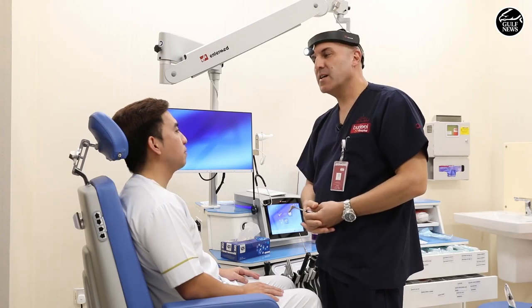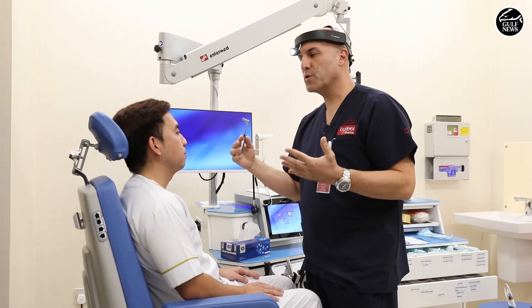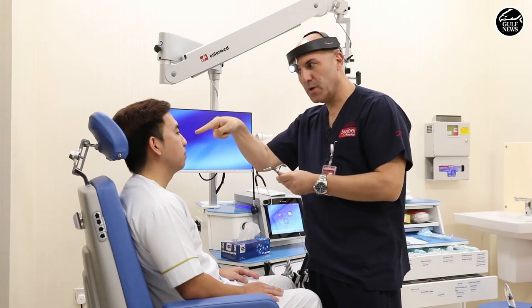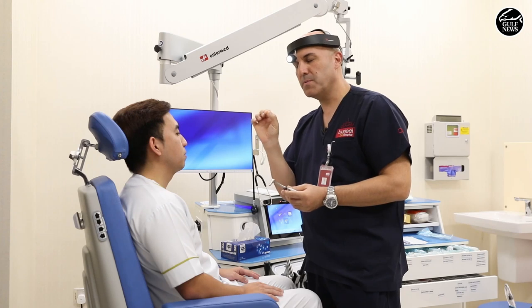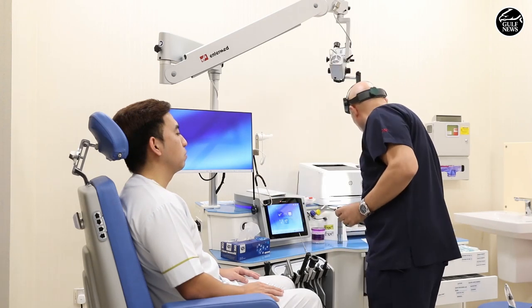So we'll start with the nasopharyngeal swab. It's very important to know that the nose — the direction of the nasopharynx goes this way and not up, not this way. It's very important. That's why when we want to direct our Q-tip or cotton bud, we have to direct it to the nasopharynx all the way to the back.